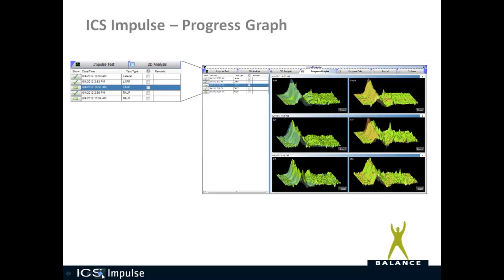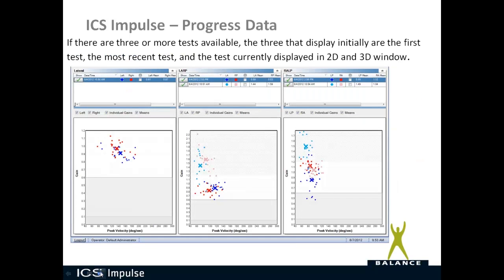The progress graph allows you to compare multiple test sessions. You can check multiple LARP and RALP test sessions and look at data across time — for example, tracking whether saccades are moving from overt to covert or have resolved. In the progress data view, when three or more tests are available, the first test, the most recent test, and the currently displayed test are shown in different colors. Each session displays mean gain for left and right and the asymmetry ratio.